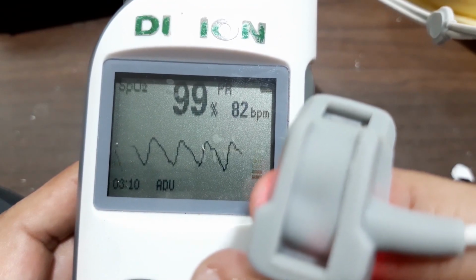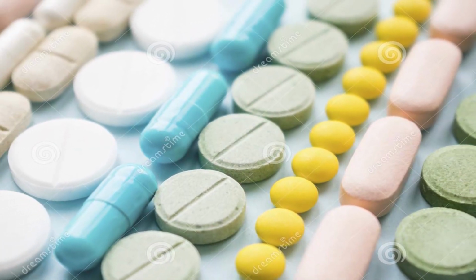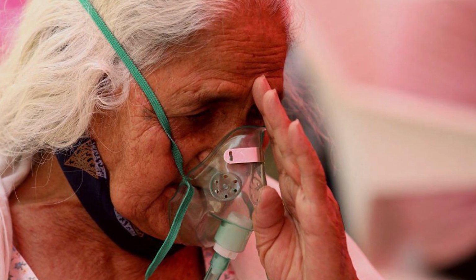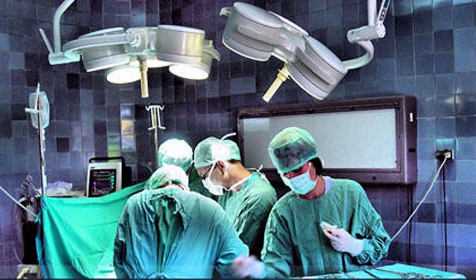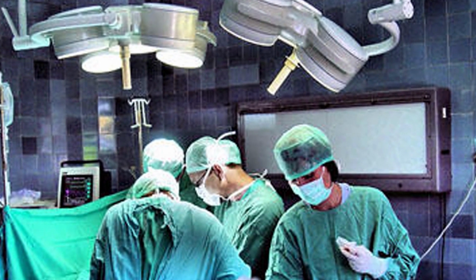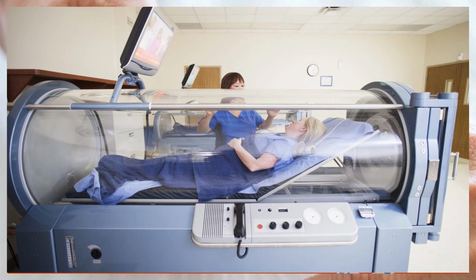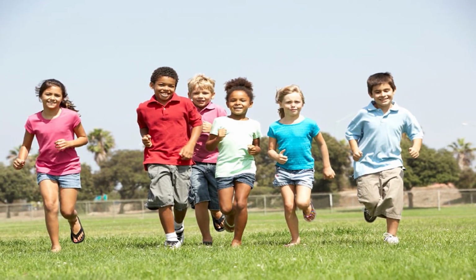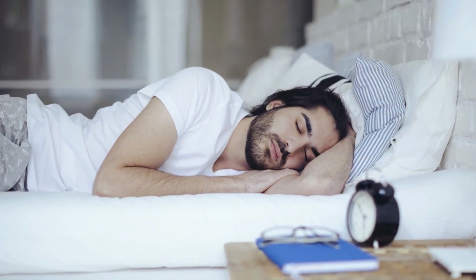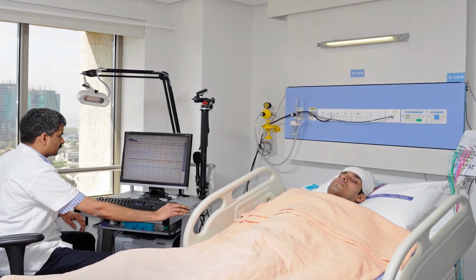There are a number of common use cases of pulse oximetry, including to assess how well a new lung medication is working, to evaluate whether someone needs help breathing, to evaluate how helpful a ventilator is, to monitor oxygen levels during or after surgical procedures that require sedation, to determine how effective supplemental oxygen therapy is, especially when treatment is new, to assess someone's ability to tolerate increased physical activity, and to evaluate whether someone momentarily stops breathing while sleeping, like in the case of sleep apnea during a sleep study.